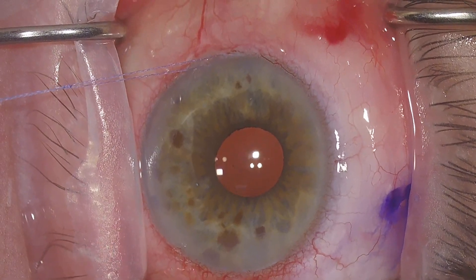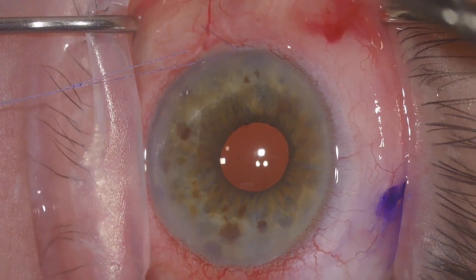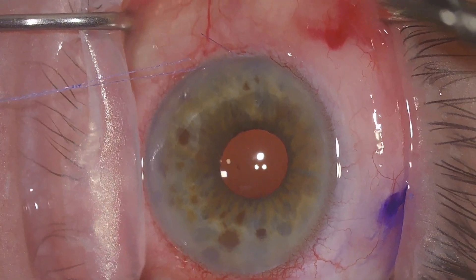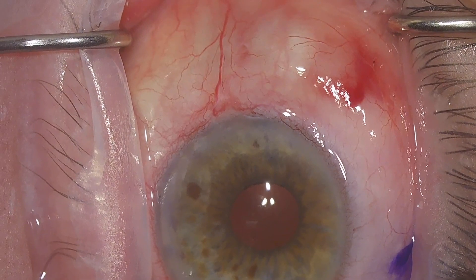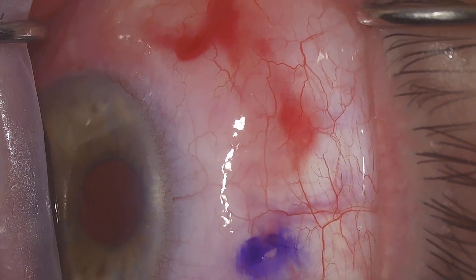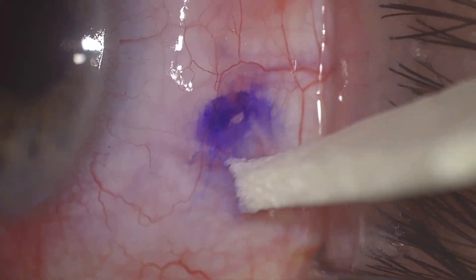I also want to point out what that traction suture did for us. Basically it helped achieve like a third hand, allowing the eye to be rotated inferiorly during the case. It did this without any pressure on the eye like the Vera hook, so there was no expression of the OVD from the anterior chamber, which really helped stabilize your chamber and rotate that eye inferiorly. It did rotate the eye into a cyclotorsion, allowing your surgical site to be more nasal — trying to approach that 12 o'clock position — also facilitating an easier placement of your Xen. I hope this technique is beneficial to your repertoire of glaucoma skills and procedures. Thank you very much.